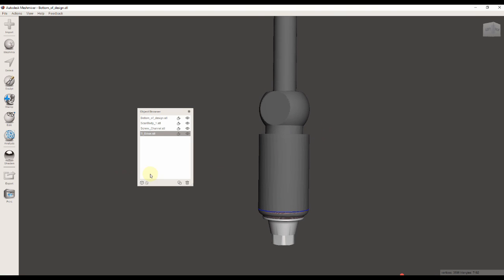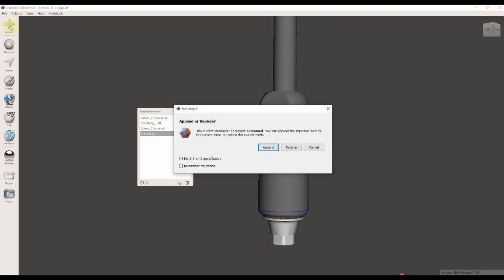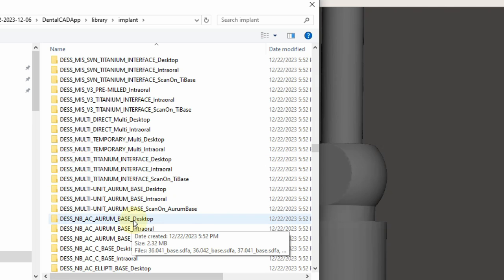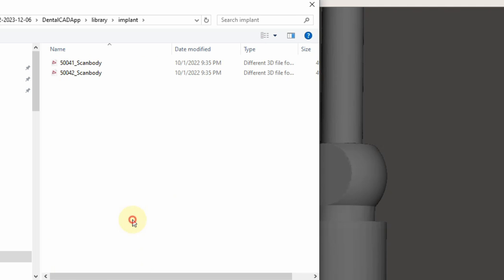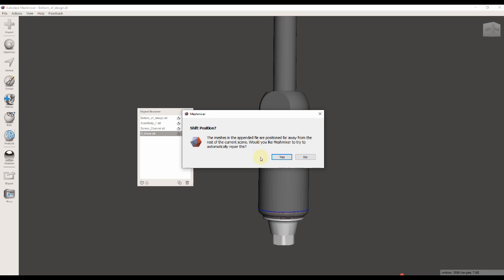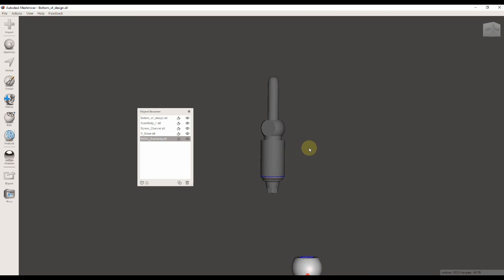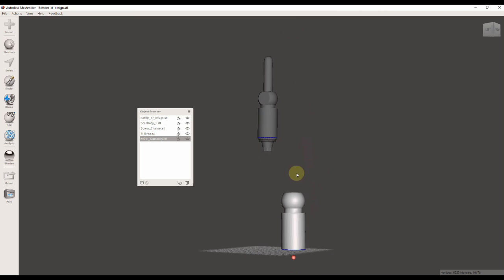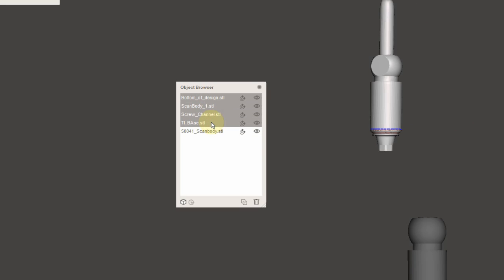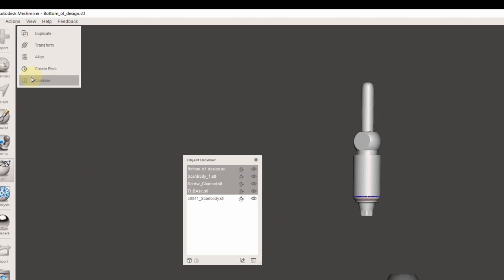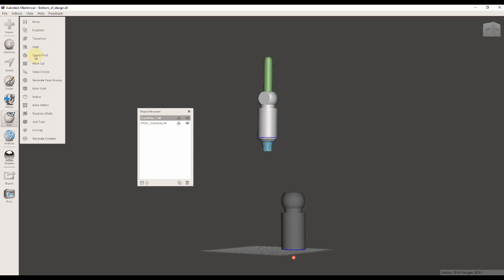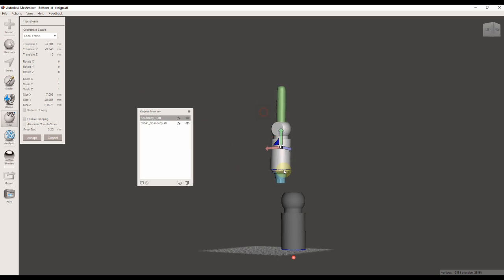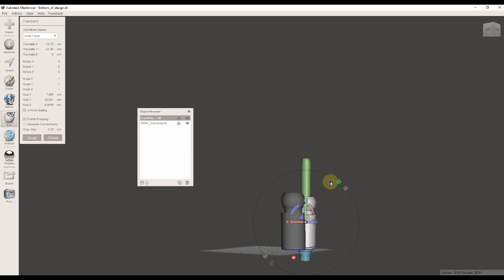Now we're going to import all the files into Mesh Mixer. Another thing that we need to import is the original scan body scan from the DESS library. Now I'm highlighting all my created parts so I can move them and align them to the original DESS scan body that's in a different coordinate system.